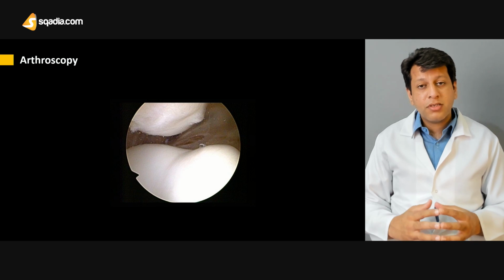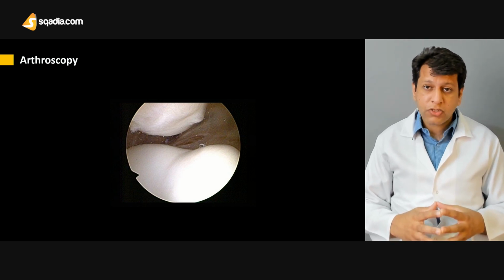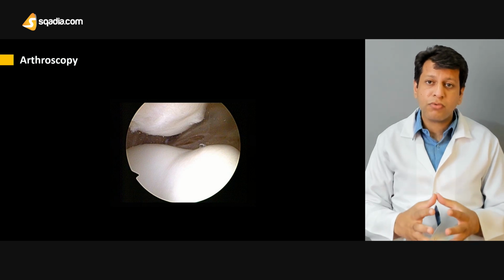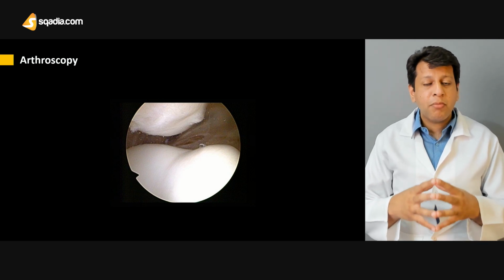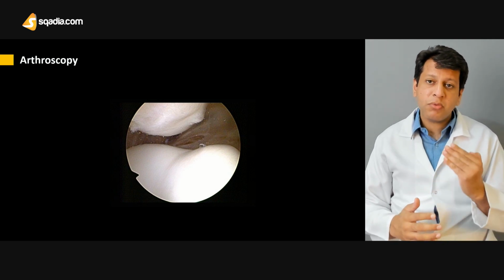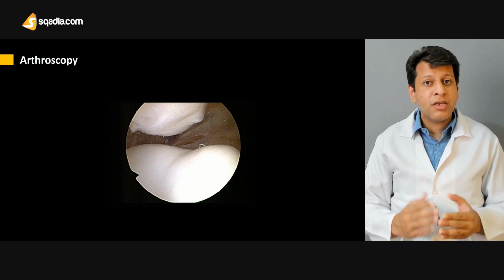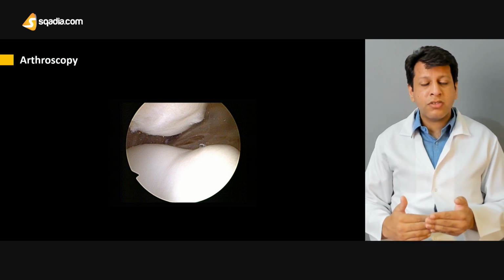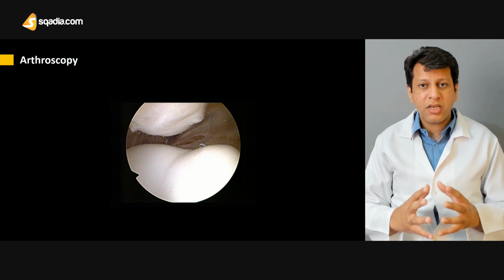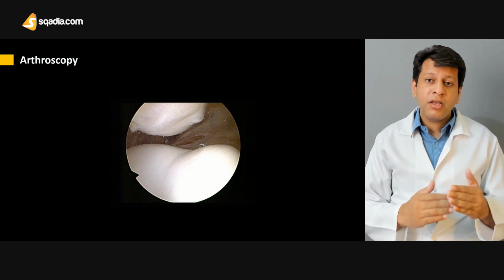When we go for MRI, there is an Outerbridge classification for chondromalacia patellae or patellofemoral pain syndrome. This has certain stages. For example, stage 1 Outerbridge is when there is only thinning of the cartilage. This is very early in the disease, and usually there is increased edema, increased fluid retention, and increased signal intensity on the T2 weighted MRI.